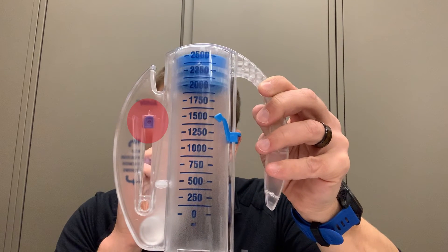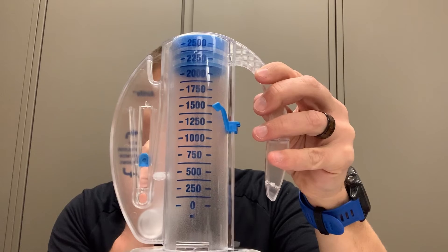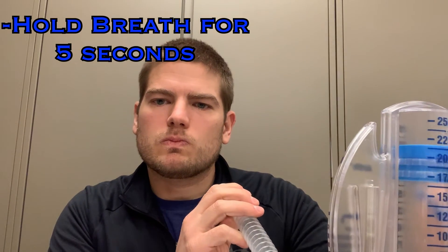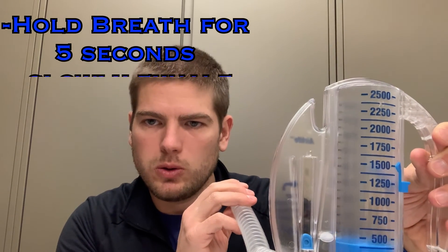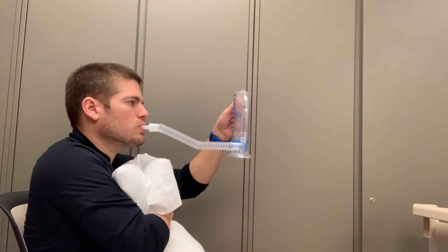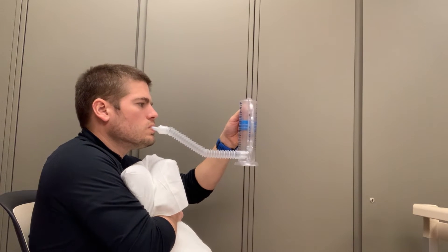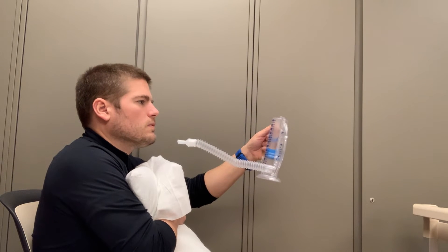If they inhale too quickly, the tab will shoot up above the arrows. Too slowly, and it won't reach the bottom arrow. When they have inhaled all the air that they can, they should try to hold their breath for at least 5 seconds, or as long as it takes for the blue plunger to drop back to the bottom of the device. Then slowly exhale. Patients that have had recent surgery may find it painful — teach them to use a pillow held tightly against their stomach while breathing to help ease discomfort.